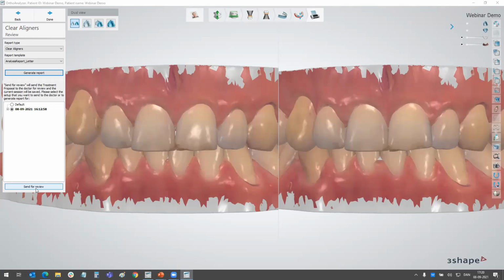We have listened. So with this new launch, even if you are a lab, you will be able to only buy ClearAligner Studio, and it will be the same pricing as you're used to if you buy it for clinics. So that would be a really reduced price compared to the full Premium package, and there you will then get all the new functionality in that ClearAligner Studio.